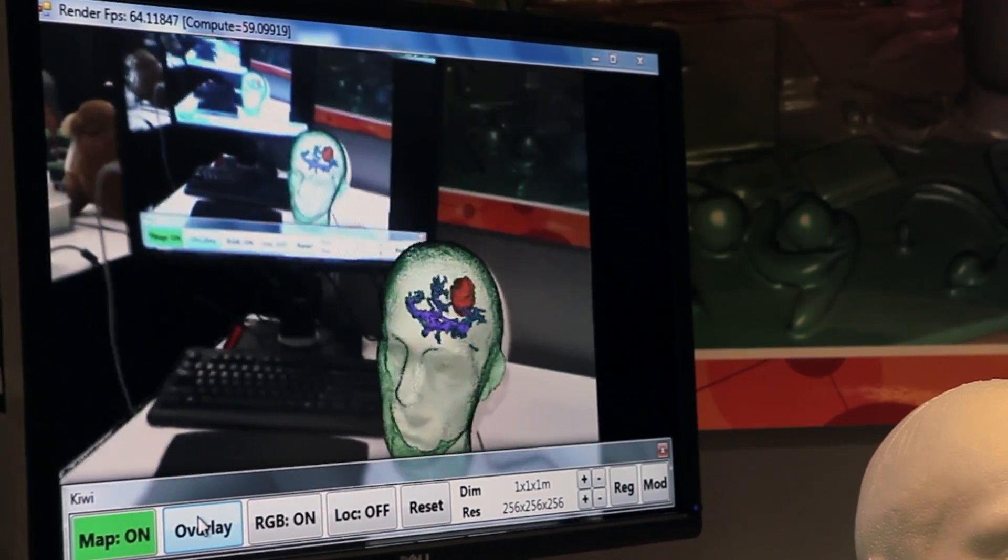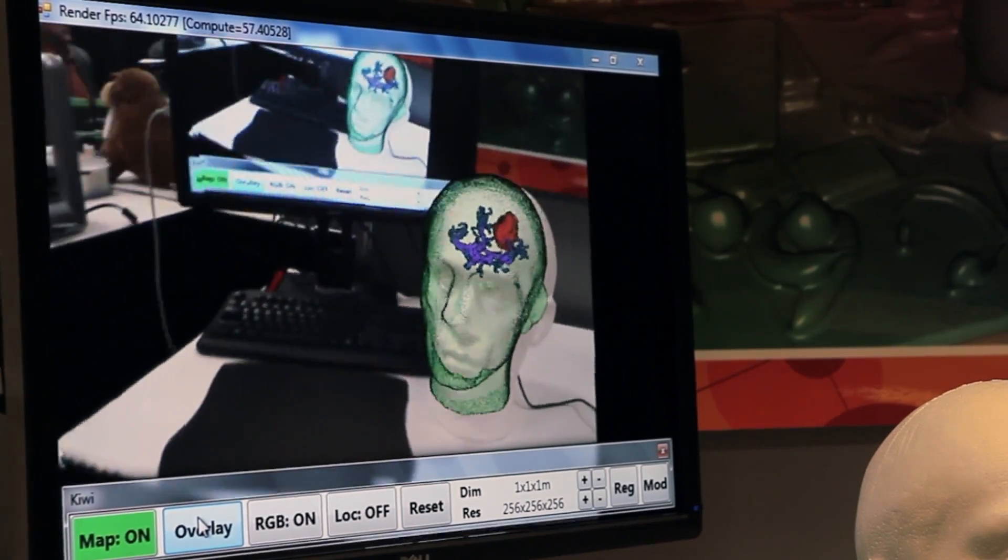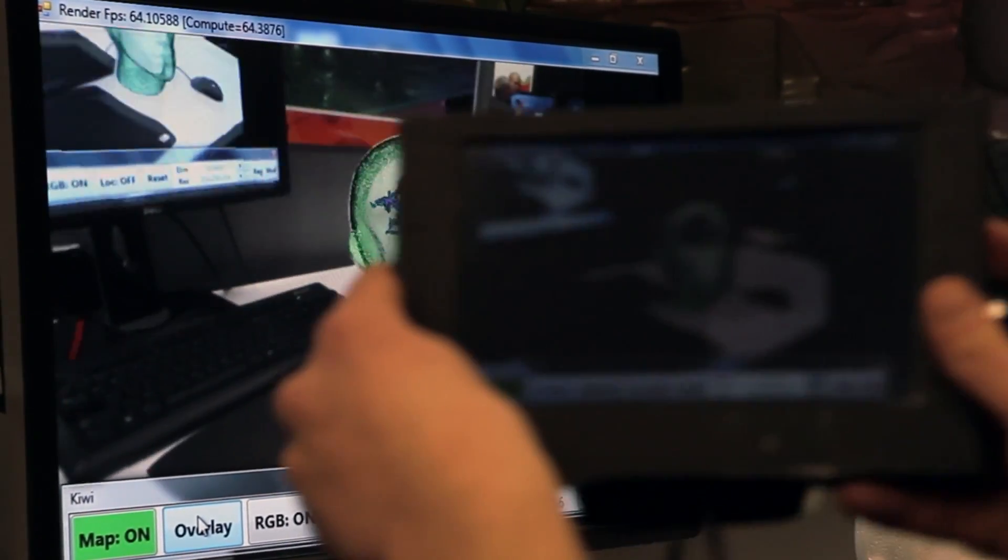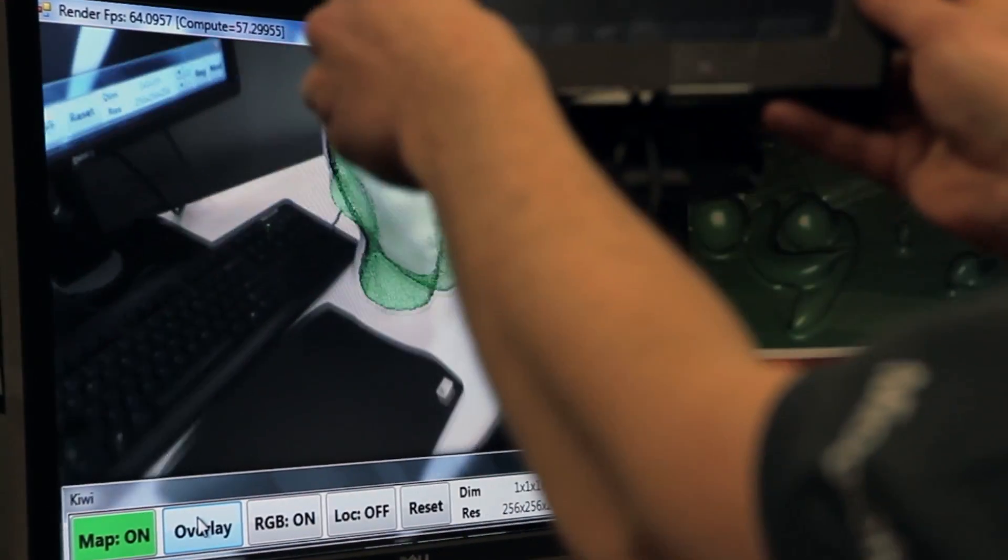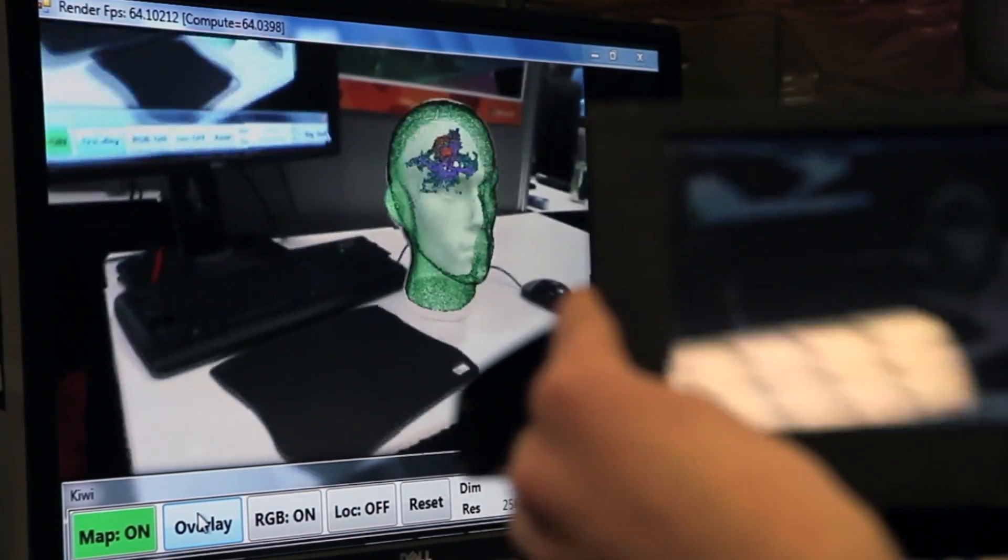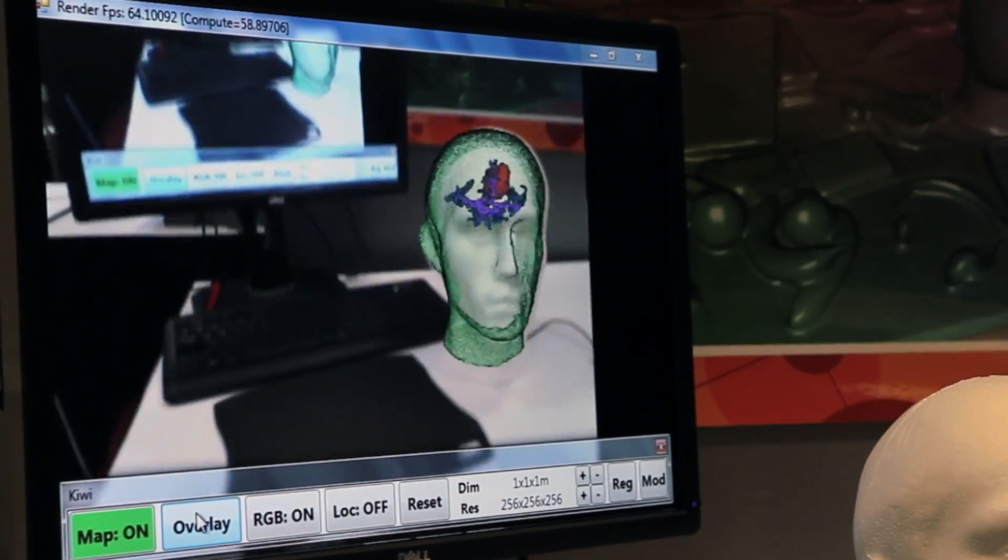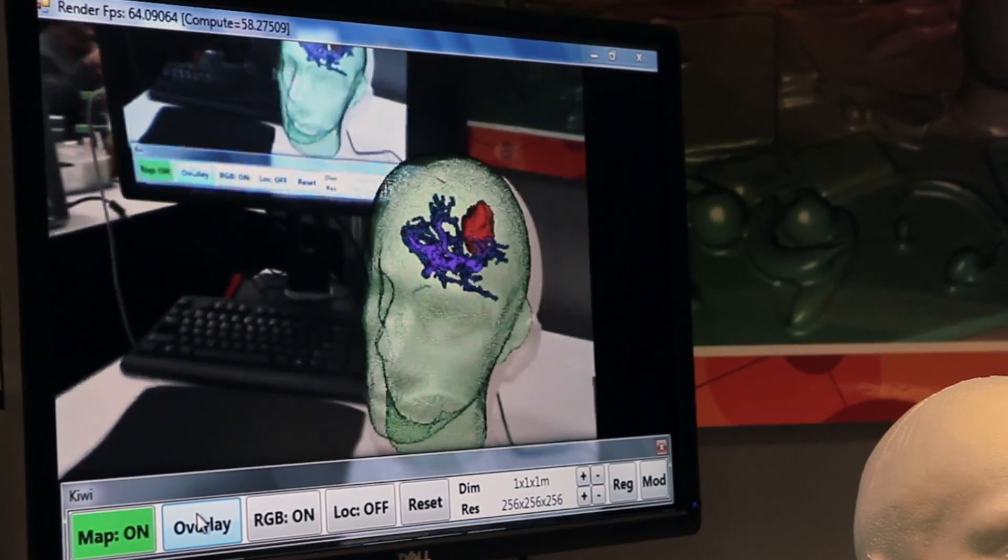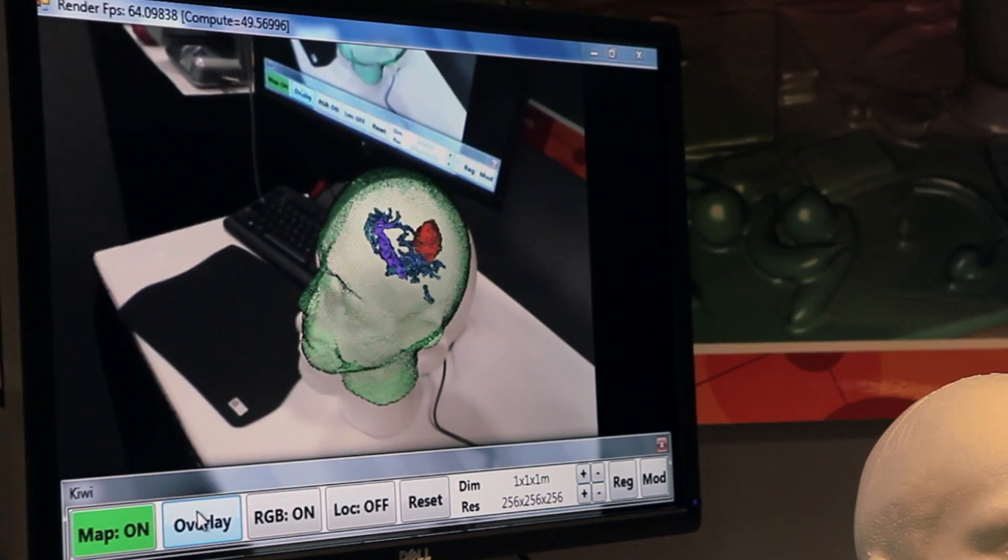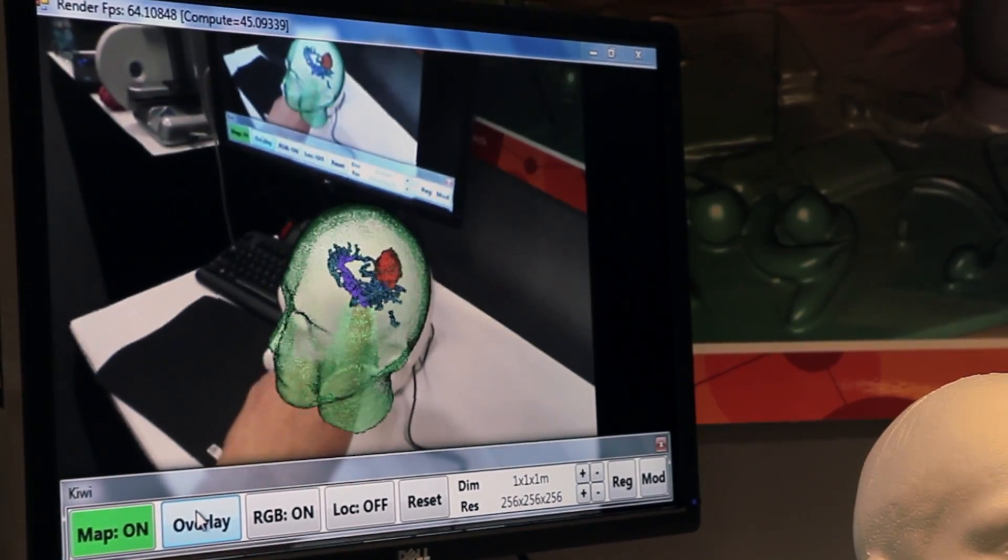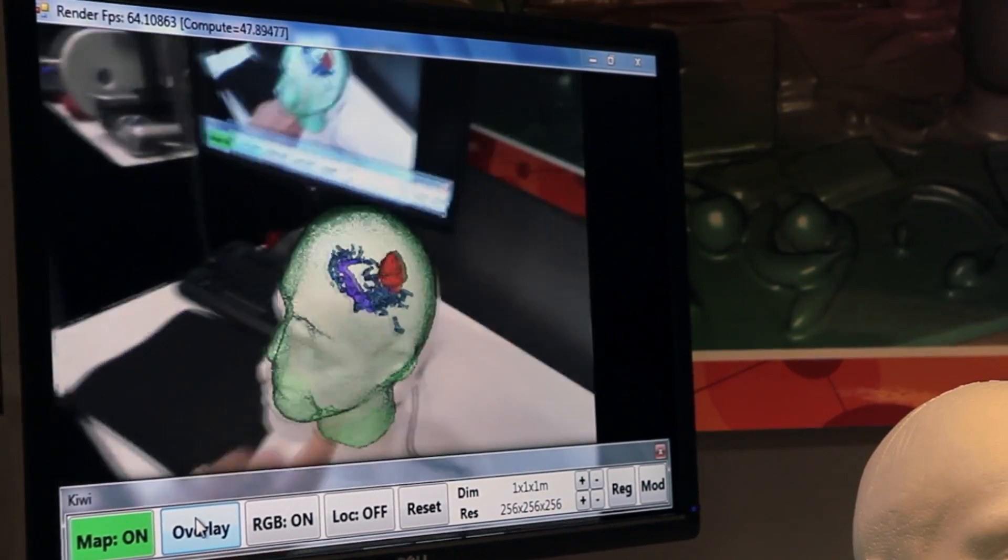And now the physician would have the ability to walk around in the operating room and look at the patient's head from different views. And basically decide what would be the best point. How do I get this red area here without destroying any important blood vessels?